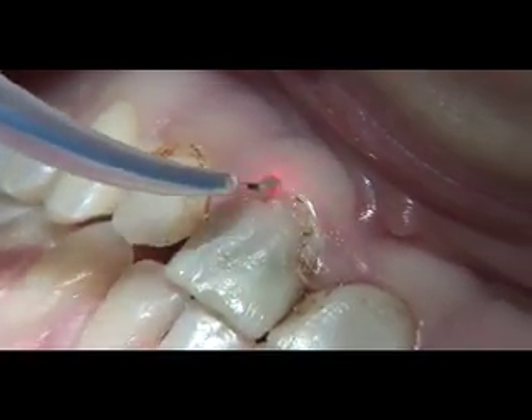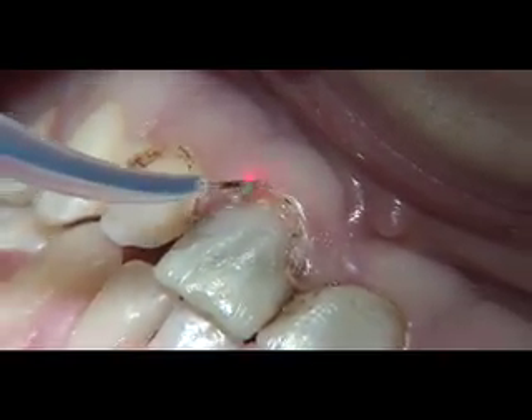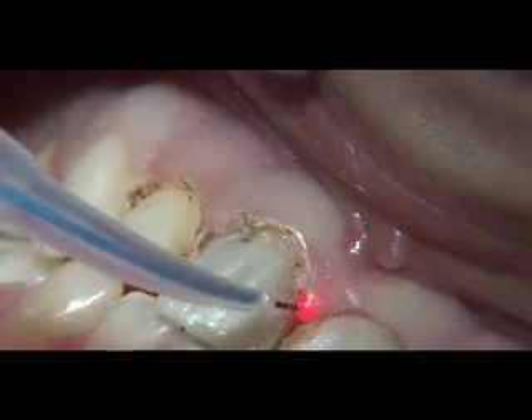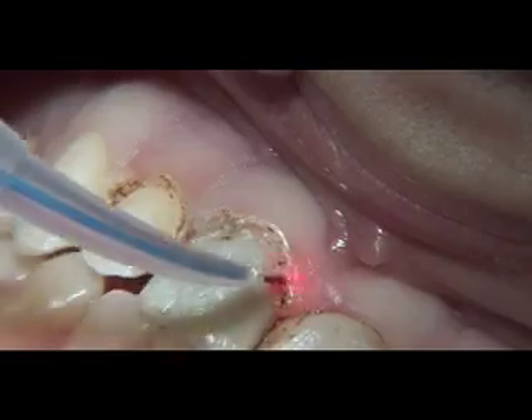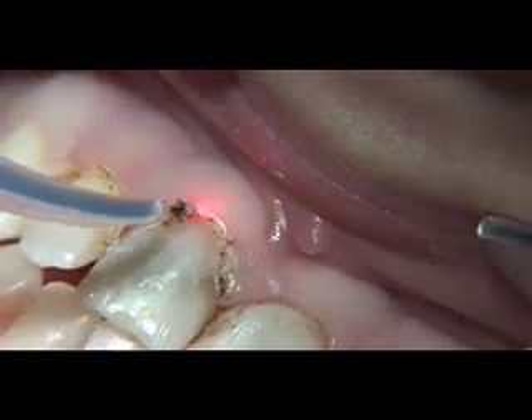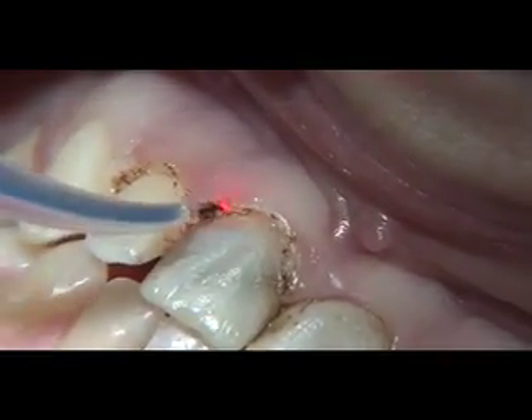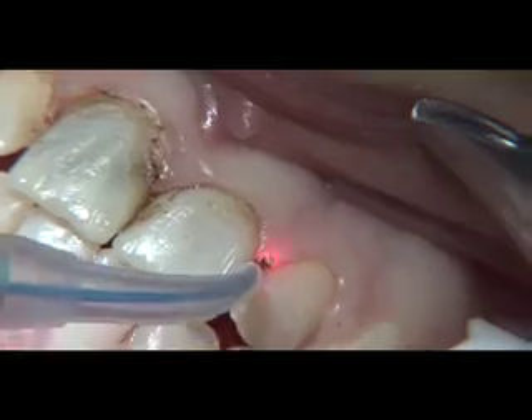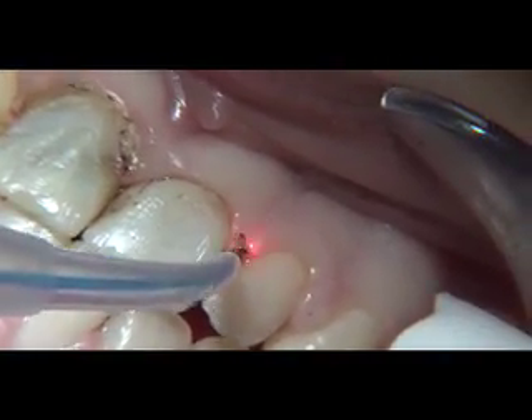Teeth seven through ten were anesthetized with one carpule of septicaine, and the interproximal papilla was also infiltrated. The laser tip is brought in contact with the tissue with a deliberate smooth brush stroke utilizing a light pen grasp. The tip is never left in prolonged contact with the tissue so as to cause unnecessary heat buildup.